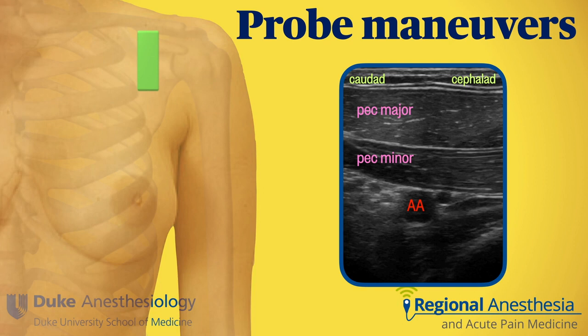There is a sequence of important probe maneuvers that set you up to see the correct anatomy and increase block success. The first is to tilt medially and then twist so the transducer is in line with a delta pectoral groove.